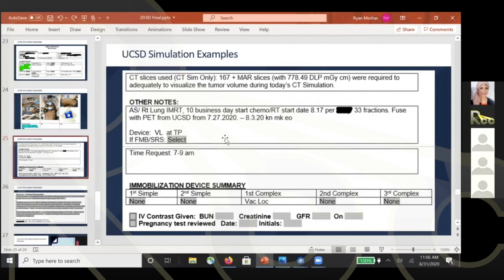Okay, we have a question from Rashid, our colleague from Sudan, asking about obese patients with pendulous breasts. How can we overcome this problem during the simulation? Well, typically any patient that is obese and has very pendulous breasts will be scanned on a prone board.